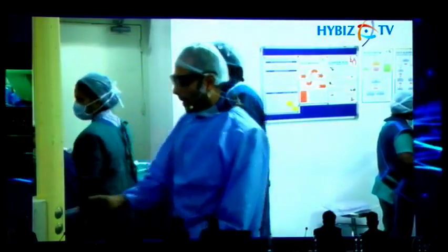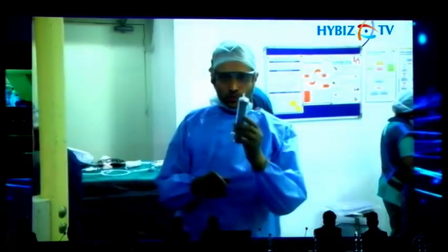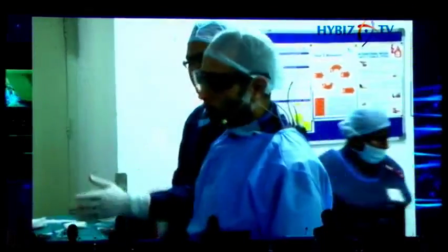So you're using a 50 cc syringe? No, I'm not. The key is don't use one of these syringes. This doesn't work. You want something with a lock. Give me 10 then. Give me whatever you have with a Luer lock. I want a new syringe with a Luer lock.